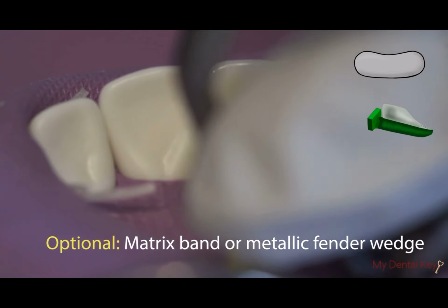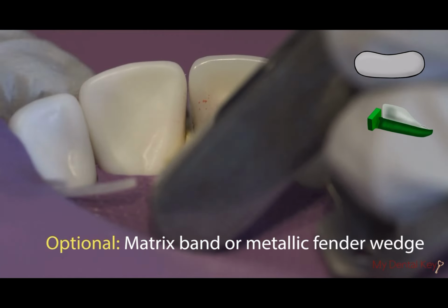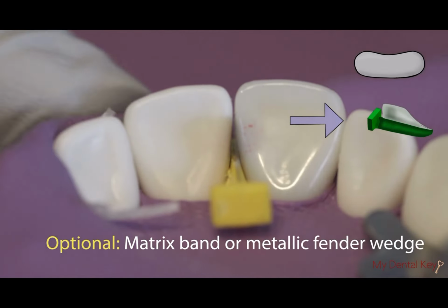Now place a wedge in between the tooth you will be working on and the adjacent tooth to separate the contact areas. As an option, you can also place a matrix band interproximally or a metallic fender wedge to protect the adjacent tooth.